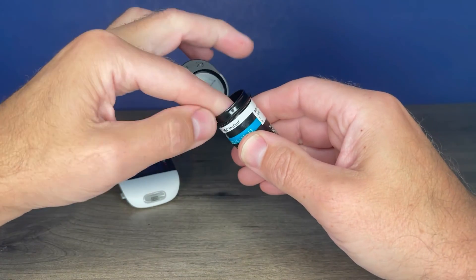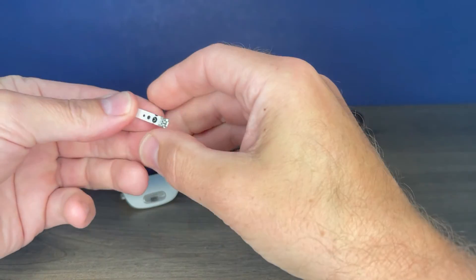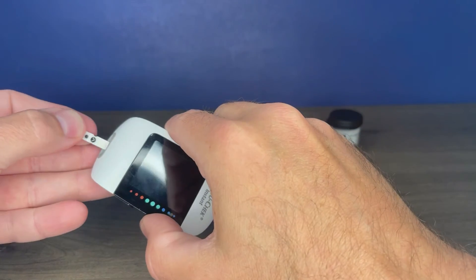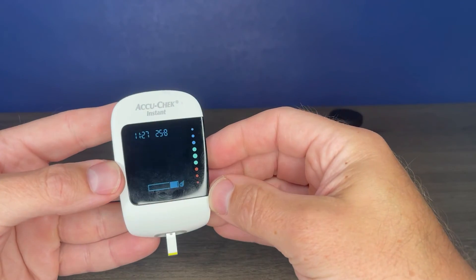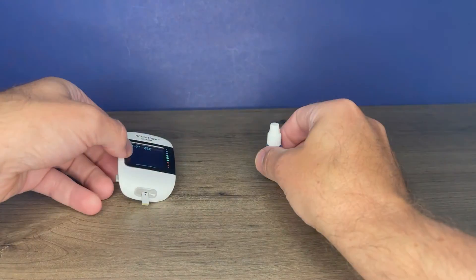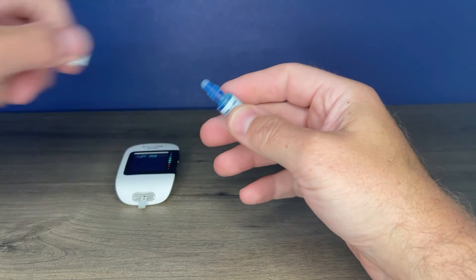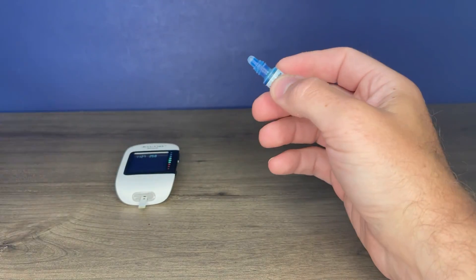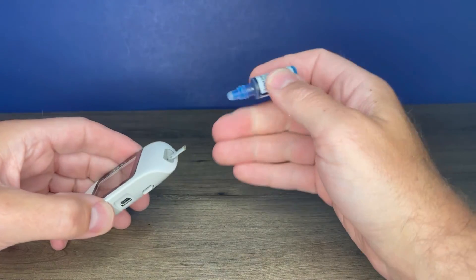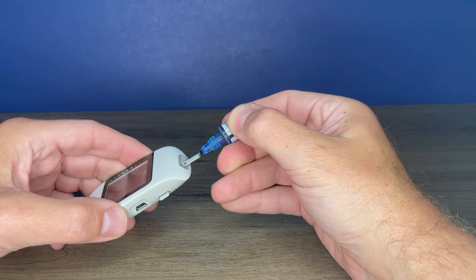Take a vial of test strips and remove one test strip. Insert the metallic end into the meter, just like you would if you were testing your blood glucose. Wait for the drop of blood symbol to appear. Then get your control solution, clean the tip off, then squeeze the bottle until you get a little drop of control solution, and touch that to the end of the test strip.